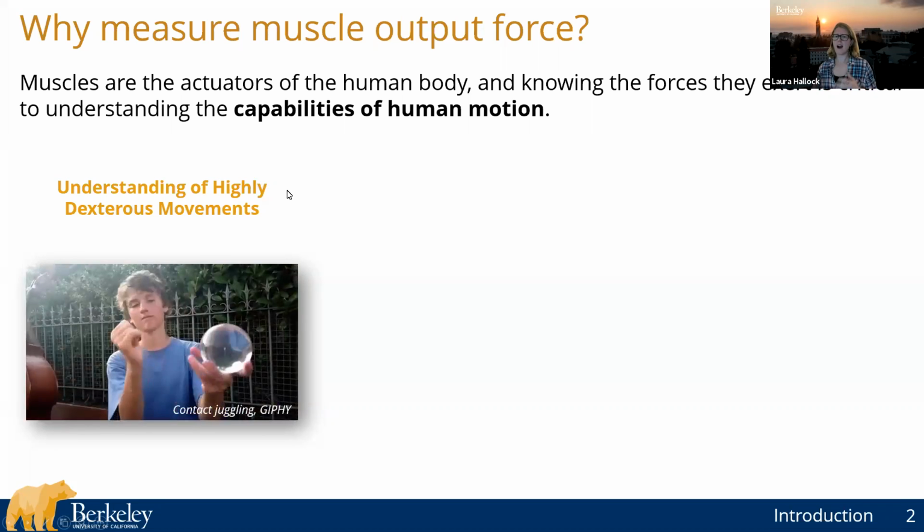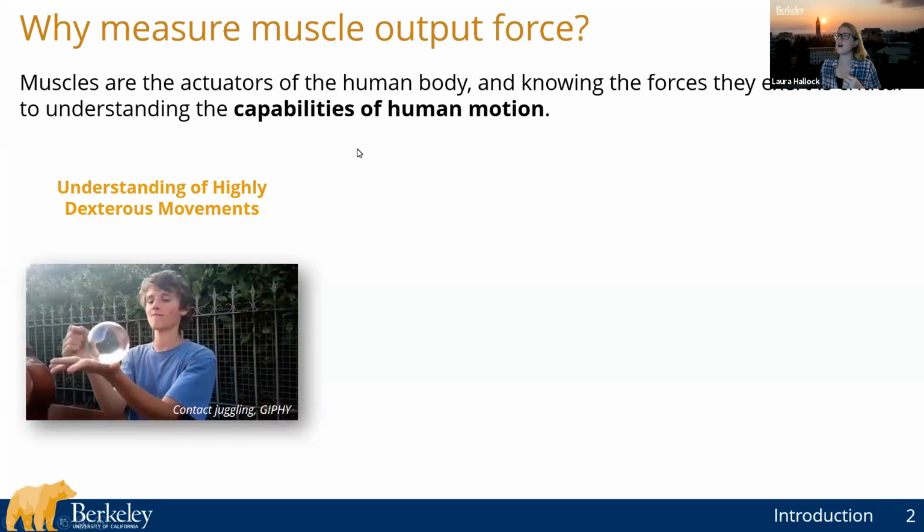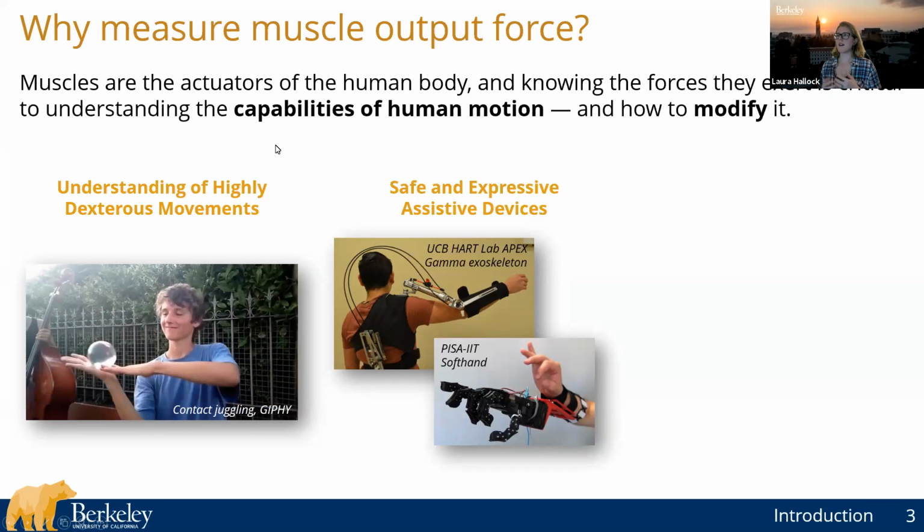And in particular, I want to highlight a couple of applications that I'm really working towards with the work that you'll see today. So first, building safe and expressive assistive devices. To unpack that a little bit, we have all these cool prosthetics. In particular, I want to talk about hand prosthetics that are anthropomorphic. They have all the right joints in all the right places, and they all have one-ish degree of freedom in terms of the control that's conferred on the user. And so those devices just aren't that expressive, aren't that capable yet, because we don't know how to control them.